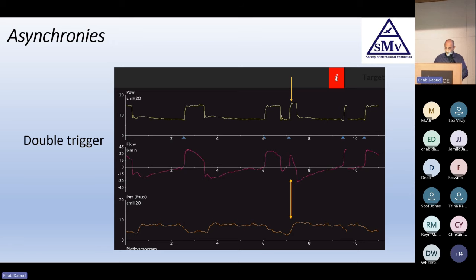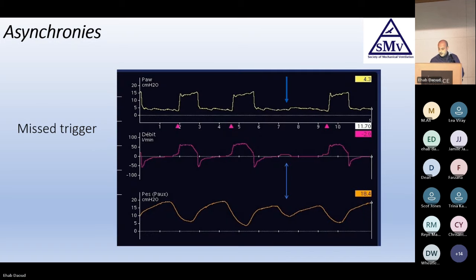Many reasons for double trigger. We're not going to go through this right now. This is one we always see.